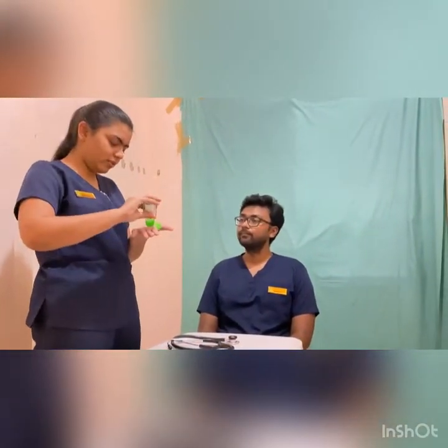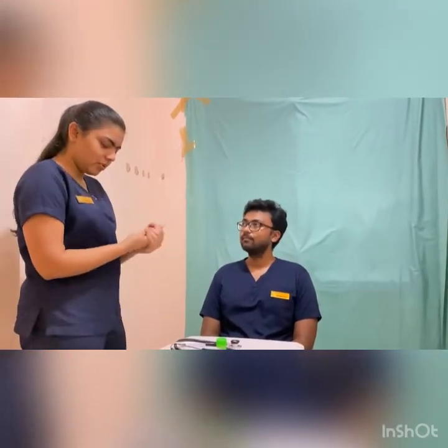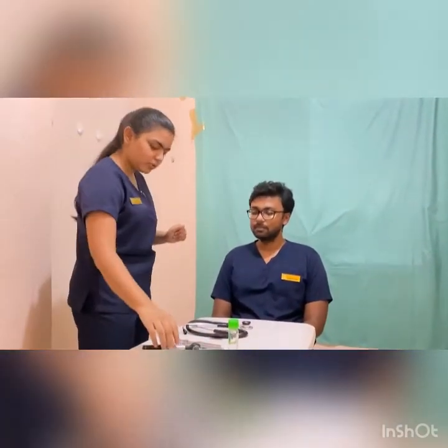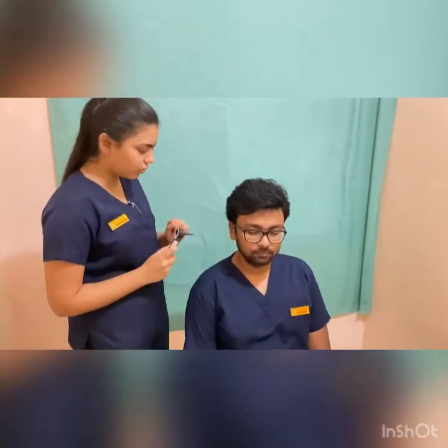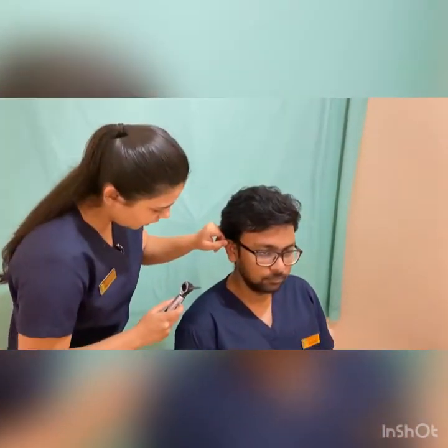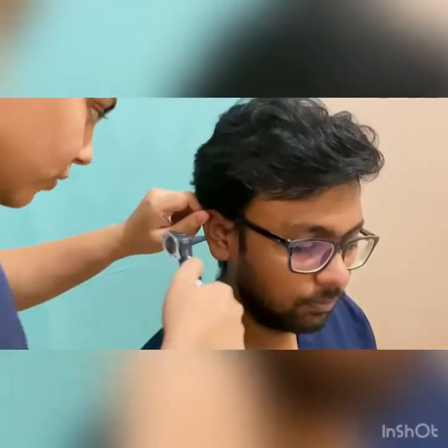Before using the instrument, make sure you sanitize your hands. Now, Mr. Subhojit, I will be placing this otoscope in your ear canal. Please let me know at any point if you feel uncomfortable. Is that okay? Okay. While using the otoscope, make sure that the helix is pulled upward and backward so that you get a better visualization.